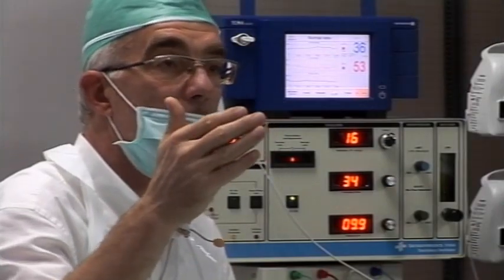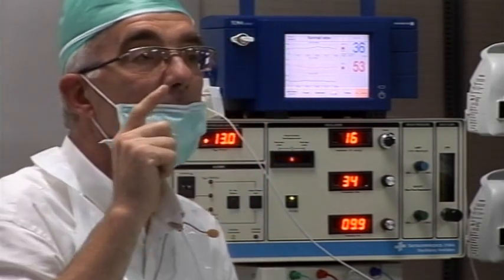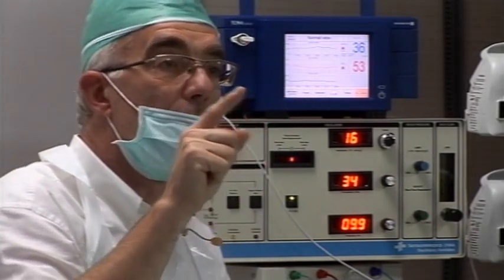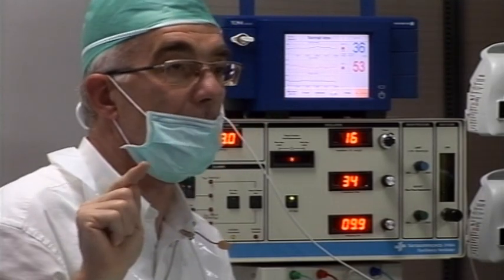Duration of ventilation for babies below 32 weeks went down to 5 days. We were coming from 15. So there is a dramatic improvement. But I cannot tell you exactly, because it was a moment where we started to use surfactant.